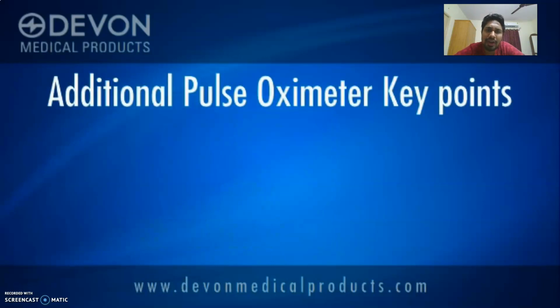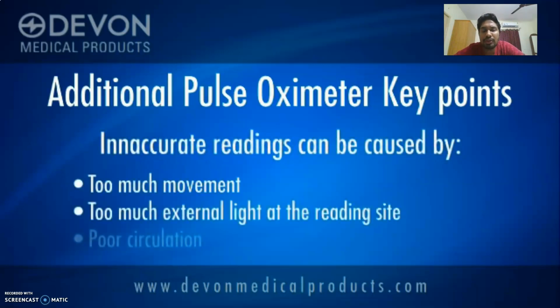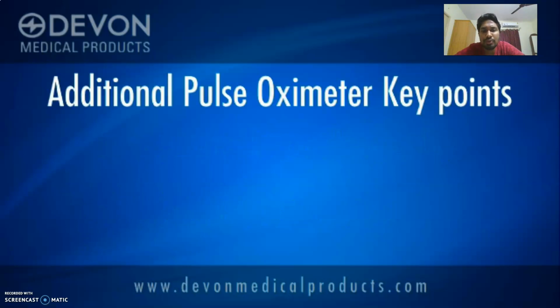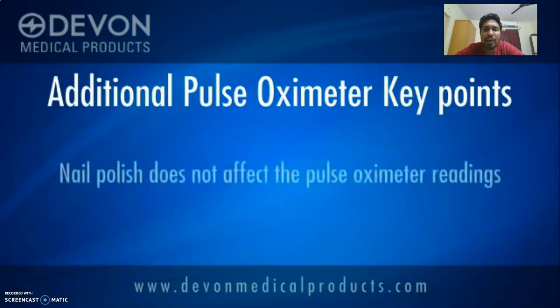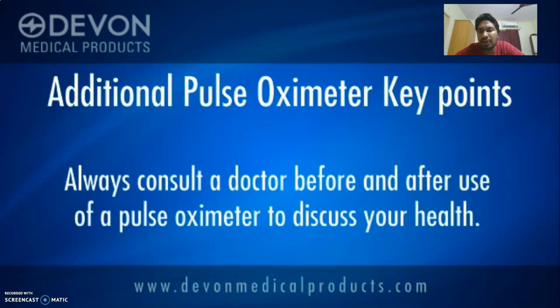So these are all the factors that you should take into mind when a company needs to provide the readings. Some inaccurate readings can be caused by too much movement, and there are certain things you have to keep in mind. And nowadays the things which are used are far better than the product which is already available.